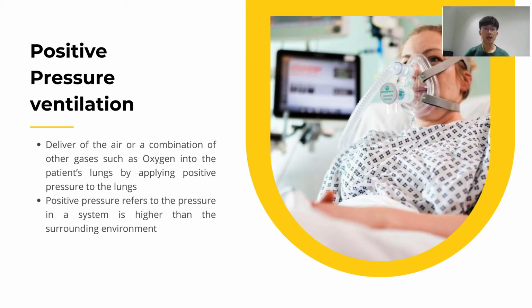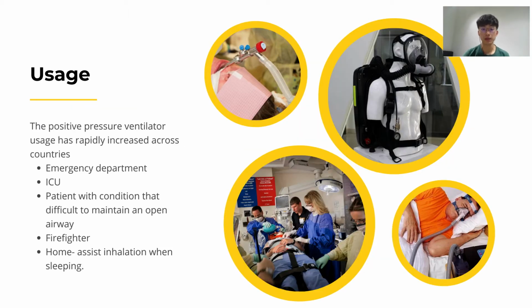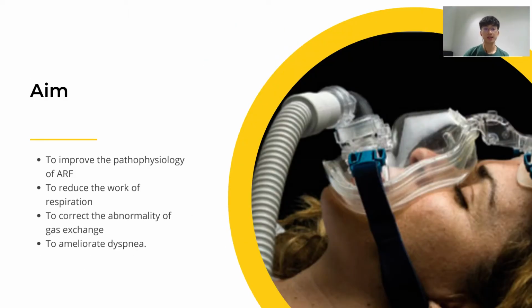Thank you, Fujin. I'm Carlo and I will be explaining the positive pressure ventilator. Positive pressure ventilator is commonly used in many treatments. The principle of positive pressure ventilator is delivering air or a combination of other gases such as oxygen into the patient's lungs by applying positive pressure.